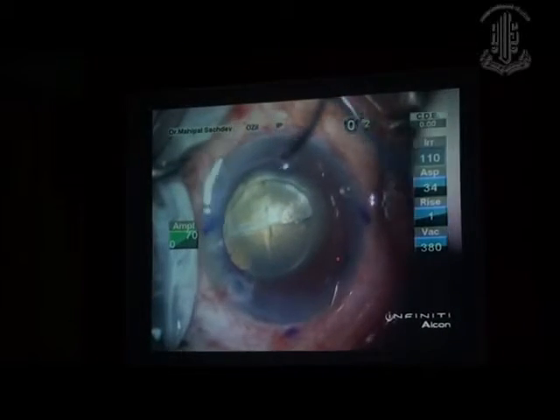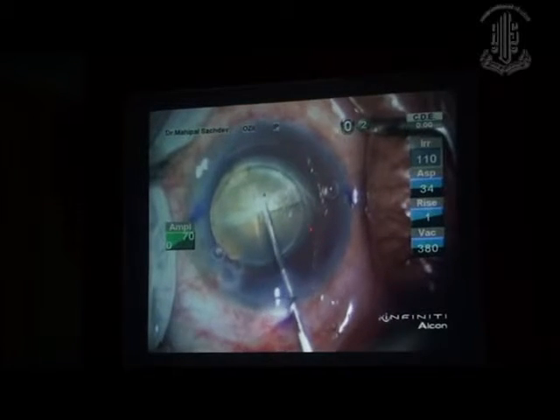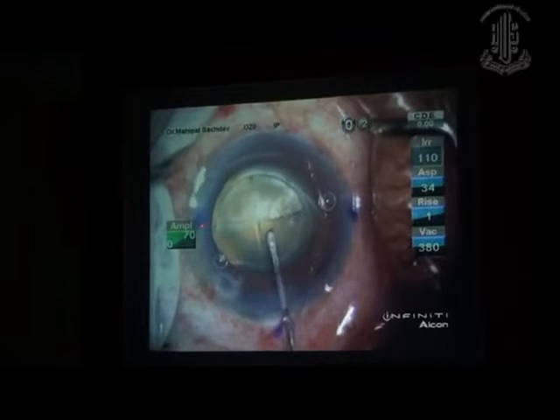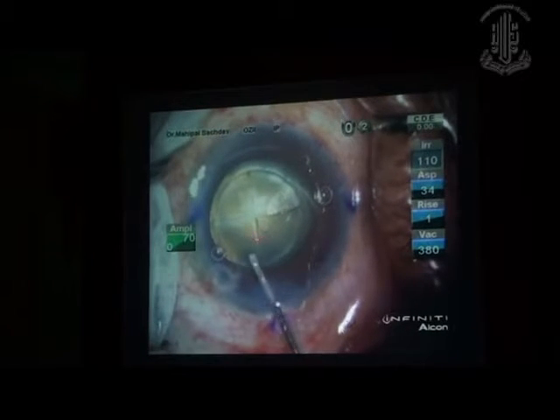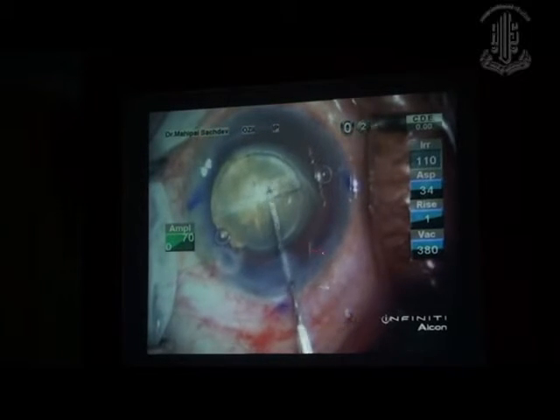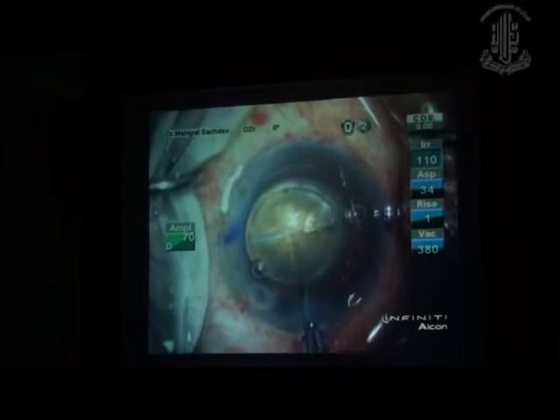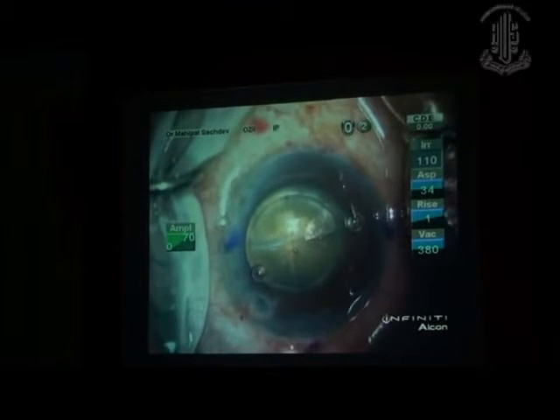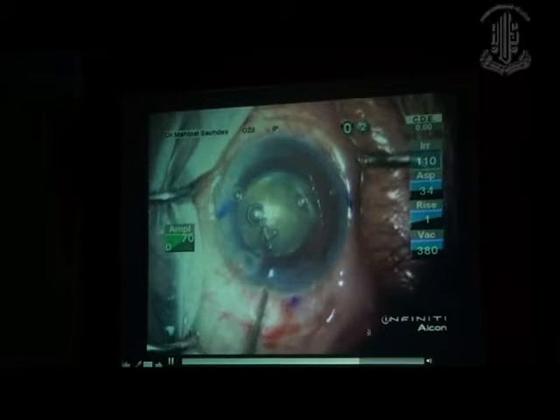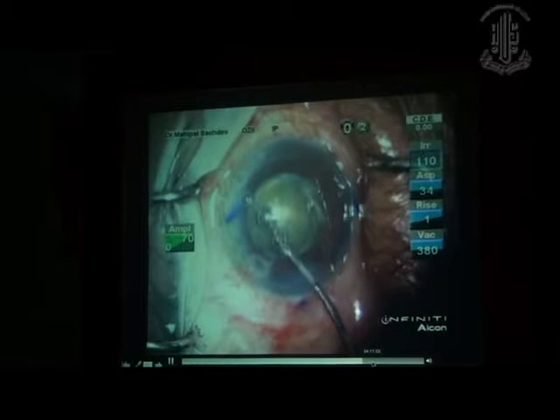You can see now, we have opened the LRI. Can you see this? This is a free-floating capsulotomy. You can see that there is hardly any adhesion, and we are able to remove the capsulotomy pretty well. Once you have removed the capsulotomy, as you can see here, that's the capsulotomy that is being pulled out. You go about, do the hydrodissection, and you can remove these quadrants.